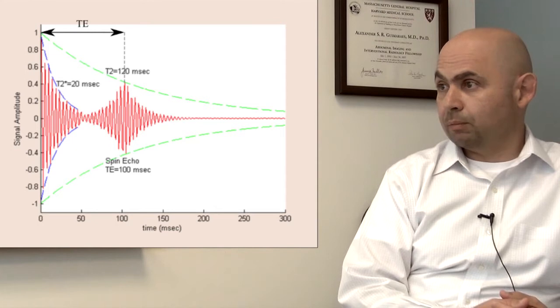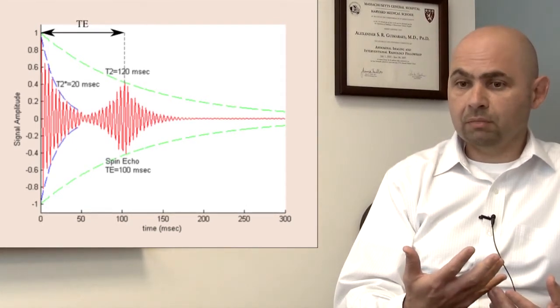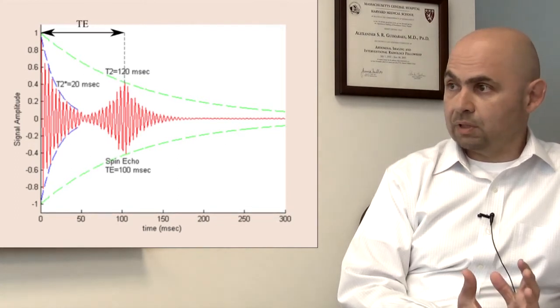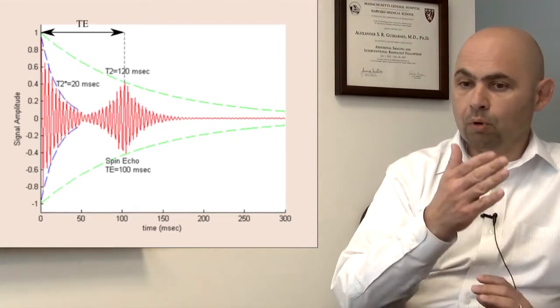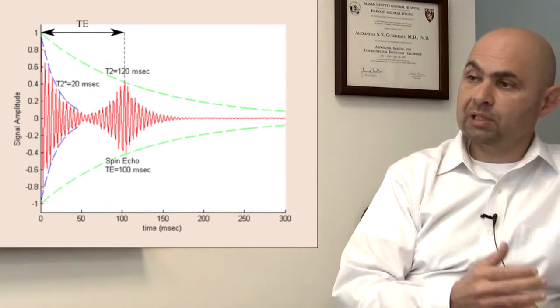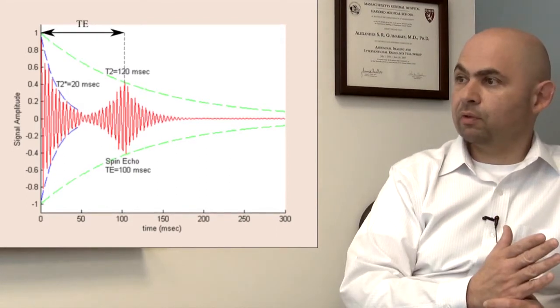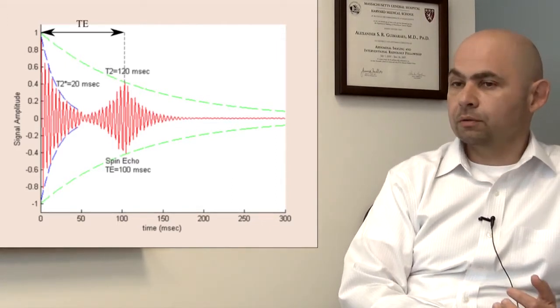If you have tiny amounts of metal or iron in your body, not only macro iron, but let's say a liver that had a lot of iron, all of those would cause subtle changes in the resonance frequency, or the B0 field, the static field, and therefore would cause more rapid loss of T2 relaxation, and that's T2 star. So T2 star is essentially always shorter than T2 because it's T2 by nature plus all of these other things that cause more variability in your spin-spin interactions.